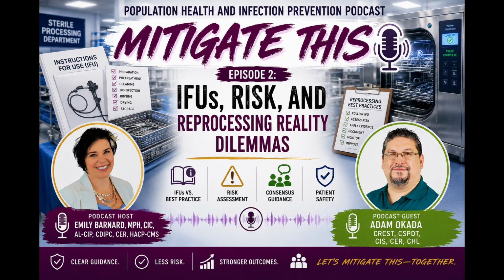One example that I give, because I do a talk on instructions for use and following them, is I give the example Olympus scopes and Karl Storz flexible scopes have two different versions of how you either flush or you pull through fluid through the scope to actually start to clean it out. And so again, one is flush and one is you're pulling that solution through from the other side. I don't even remember at this point which one is which, but they have these two different instructions. But when I see people doing it, they always do it the same way. Every scope is flush, right? They're not pulling that solution through.